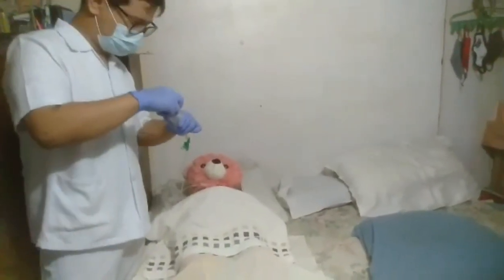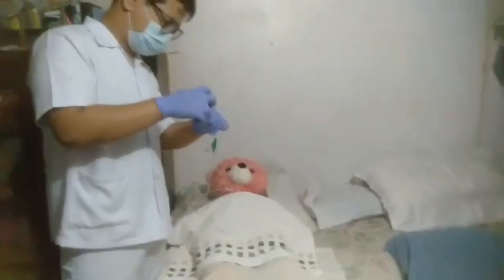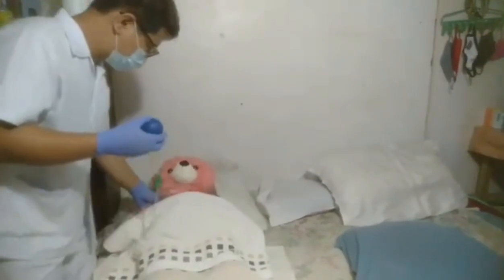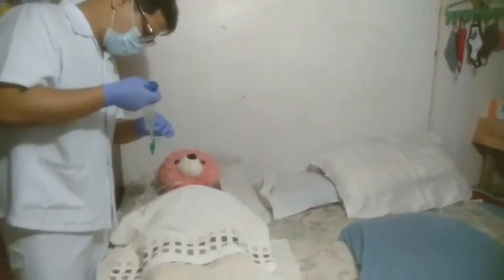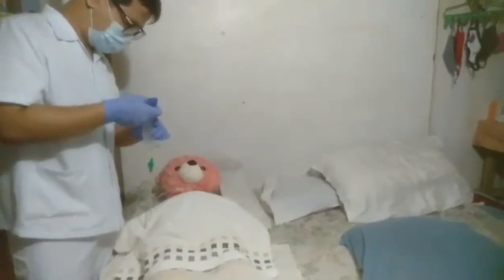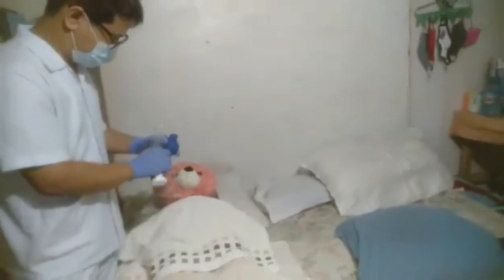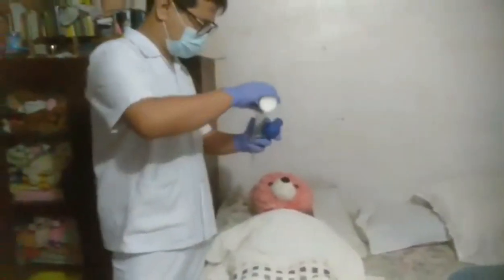And then assist the patient. Make sure to assist the patient in a Fowler's position in bed or sitting position in a chair. If a sitting position is contraindicated, a slightly elevated right side lying position is acceptable. If the patient has continuous tube feedings, close the tube feeding pump temporarily, and then check tube placement. Fold the tube over the clamp with fingers.